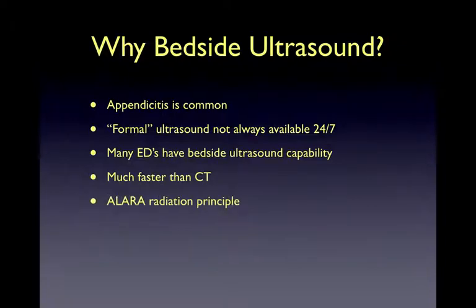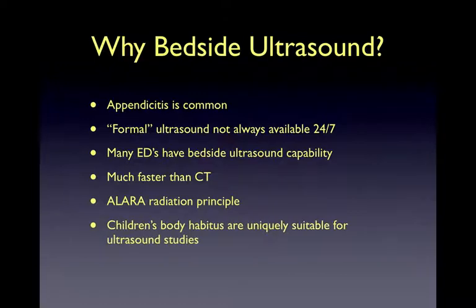Because it is consistent with the ALARA, as low as reasonably achievable, ionizing radiation dose principle. Because children's body habitus are uniquely suitable for ultrasound studies. In other words, there isn't much in the way of sound wave penetration.